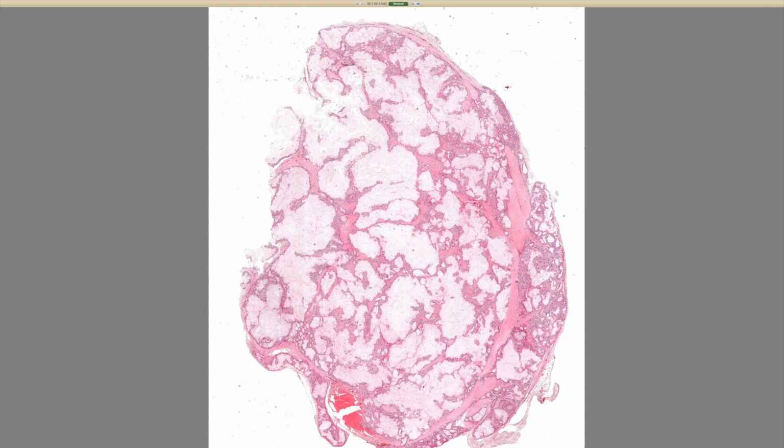And in derm path, we use the term a little bit loosely compared to the rest of pathology, because we say things are granulomatous sometimes when we just mean that they are rich in histiocytes. So sometimes things that we would call granulomatous in dermatopathology, because they have an abundance of histiocytes, the rest of pathology might be like, where's the granuloma there? I don't see it. So just know that there are some things like that where we use the word granulomatous very loosely in dermatopathology. So with that said, let's do some cases.